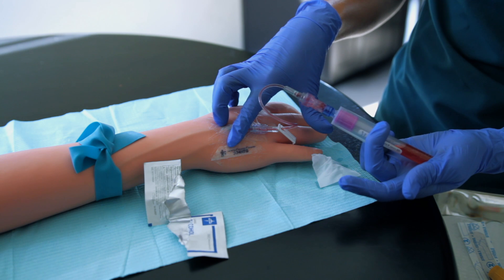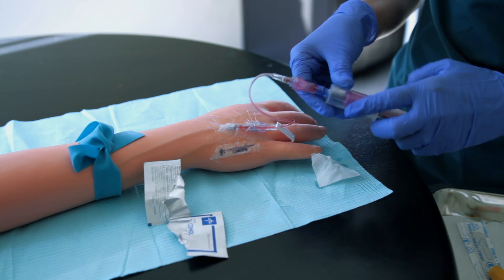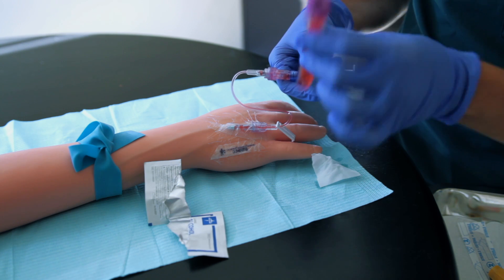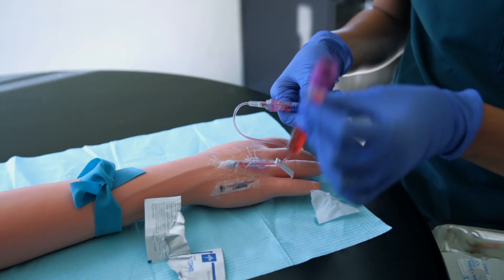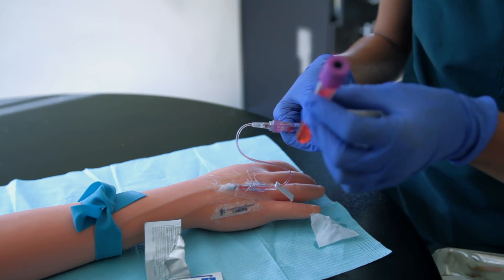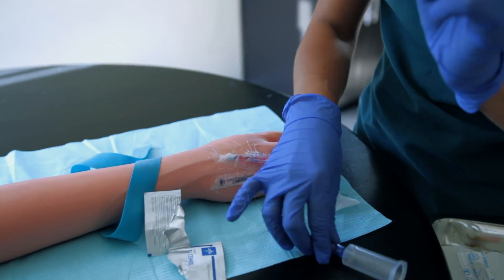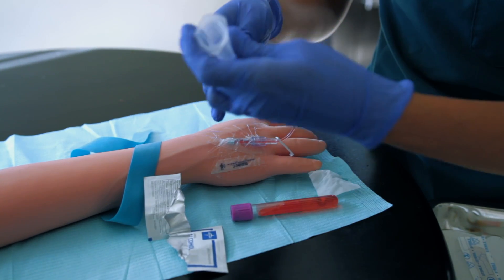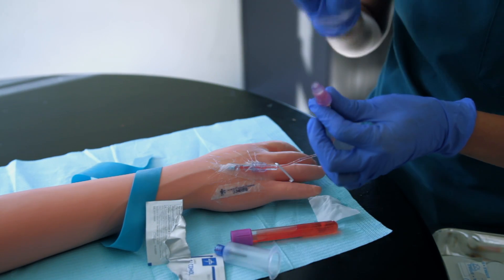Now I'm going to put in my purple top tube and it is just flowing nicely. I'm going to disconnect and invert it — about eight to ten inversions at 180 degrees, not 360, otherwise it can produce hemolysis. Then I release my tourniquet.